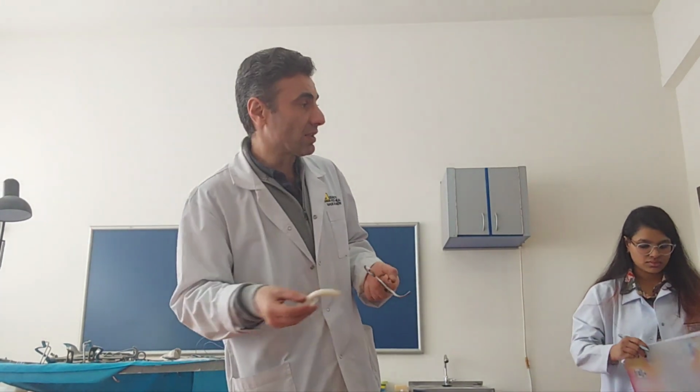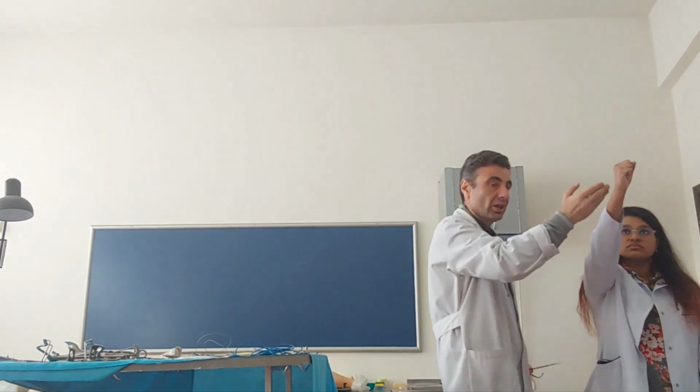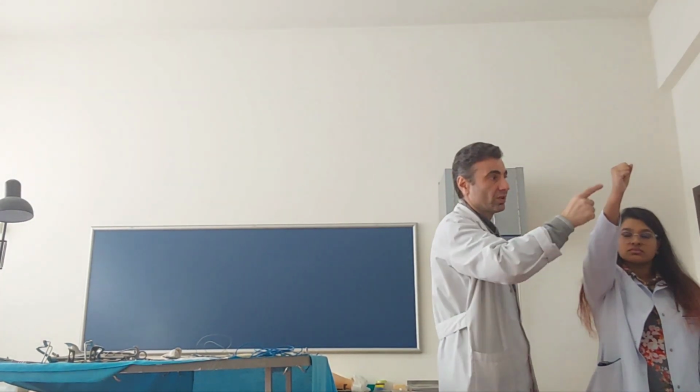Then, when the respiratory system is obstructed, you have a few minutes to make this simple manipulation, which is called tracheotomy, tracheostomy. What does tracheotomy, tracheostomy mean? Hold your hand like this. Now this is the trachea. In some place, for example in the region of the face, it is obstructed. Or maybe it is the larynx.